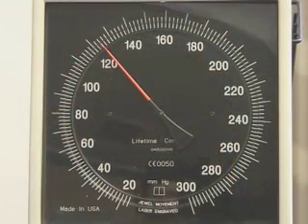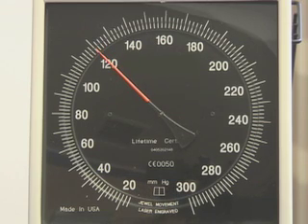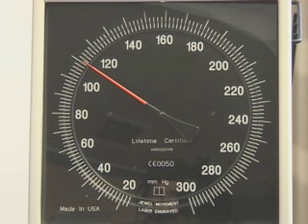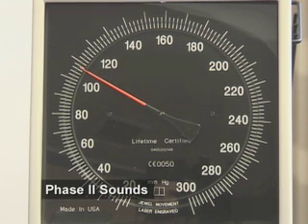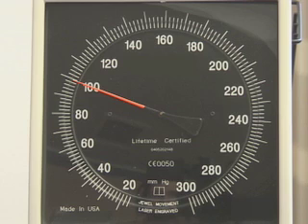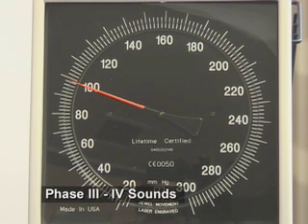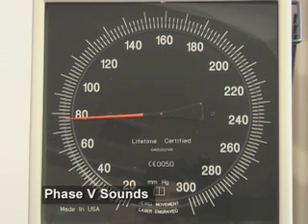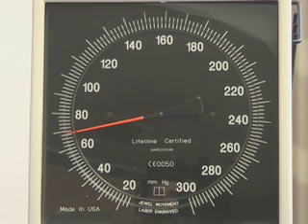Phase 1 sounds are clear, repetitive tapping sounds that coincide with reappearance of a palpable radial or brachial pulse. The onset of Phase 1 sounds is equivalent to the systolic blood pressure. Phase 2 sounds are audible murmurs in the tapping sounds. Phase 3 and 4 sounds are muted changes in the tapping sounds that occur as the pressure measurement approaches the diastolic pressure, usually within 10 millimeters of mercury of true diastolic pressure. Phase 5 sound is not really a sound, but rather is the level at which sounds disappear. Phase 5 indicates the diastolic blood pressure.